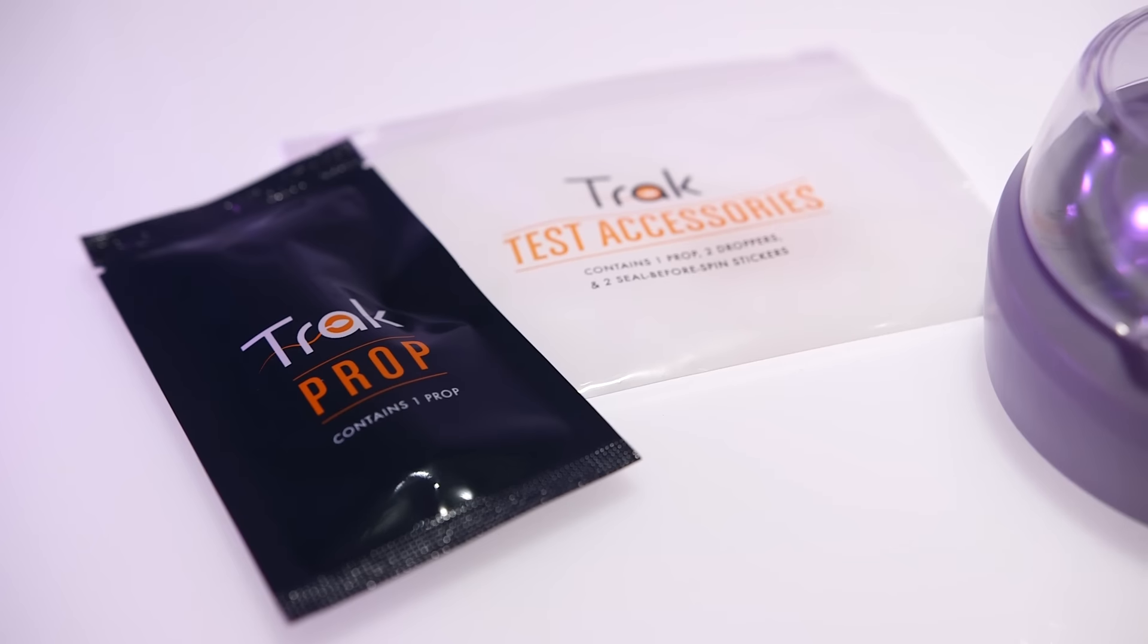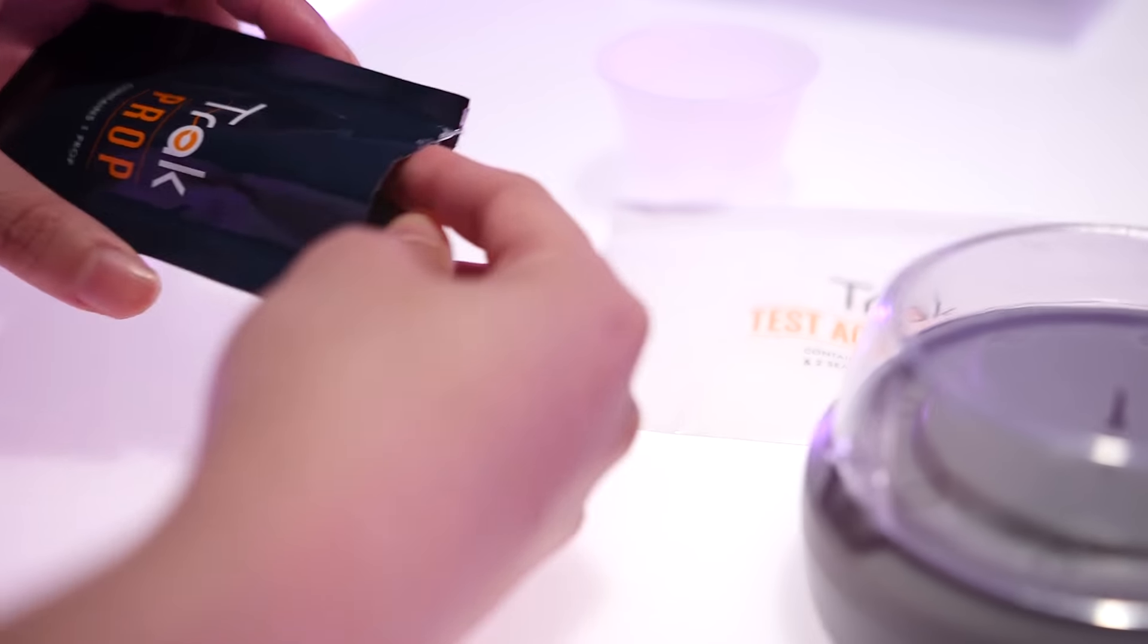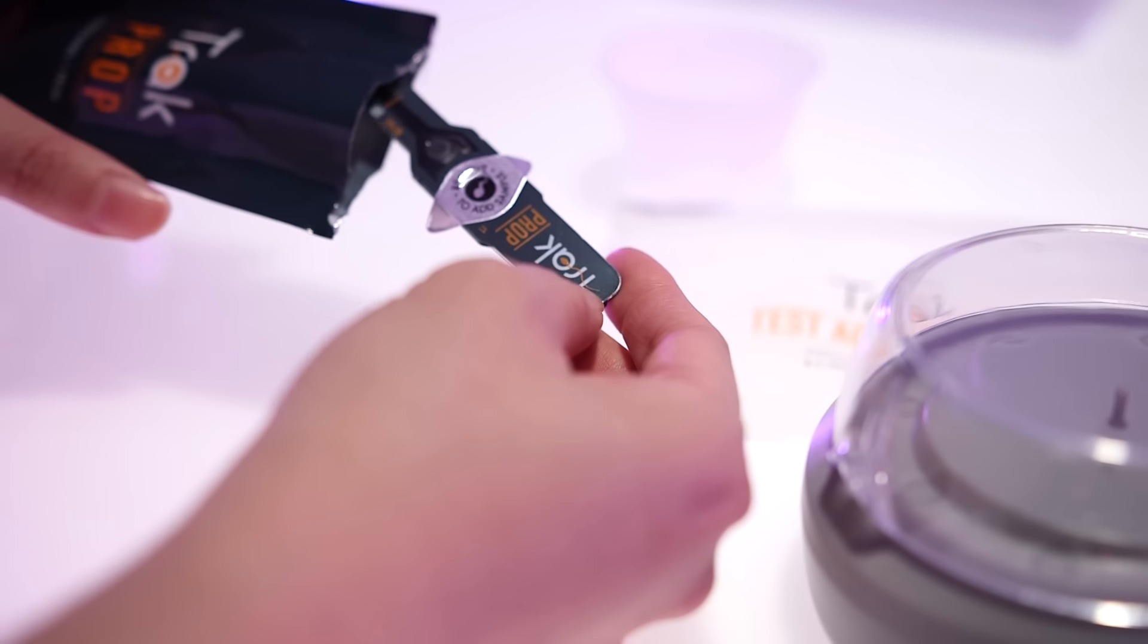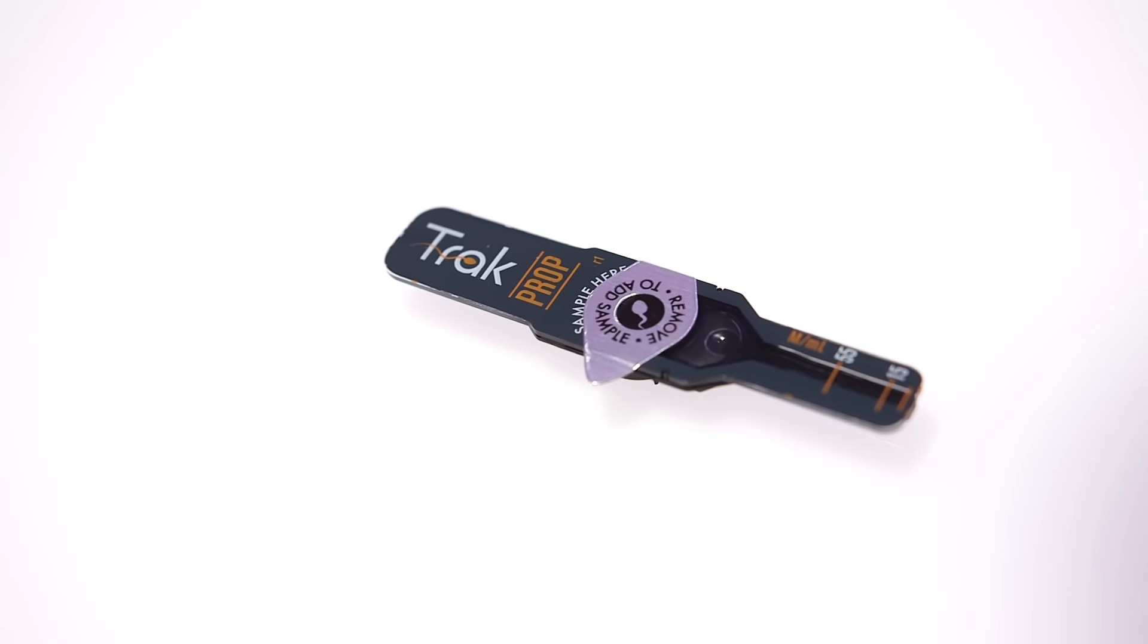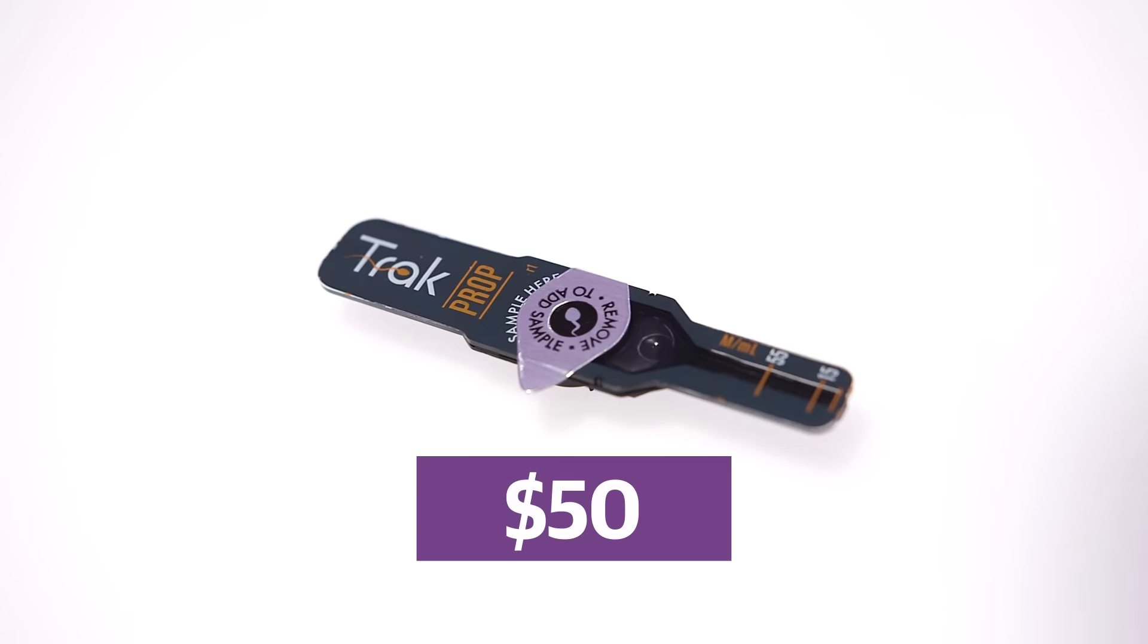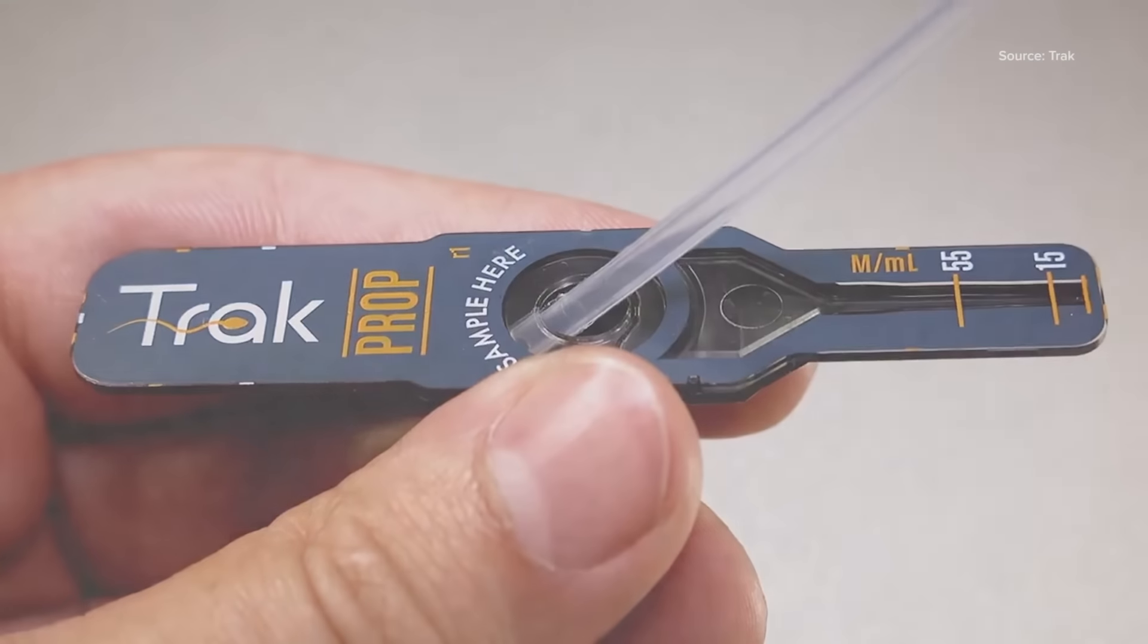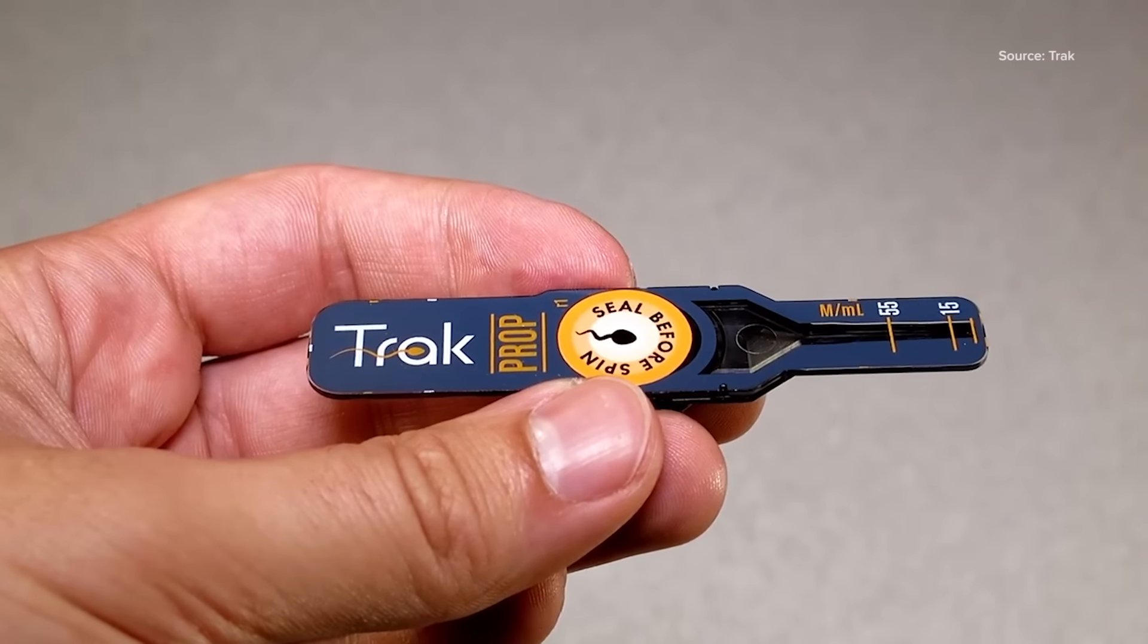Then, put one of the sticks that TRACK calls props onto the main module. Each $200 kit comes with four sterilized props, and you can buy more at $50 per pair. Using the included dropper, place a drop of your sample in the middle of the prop and close the module's lid.